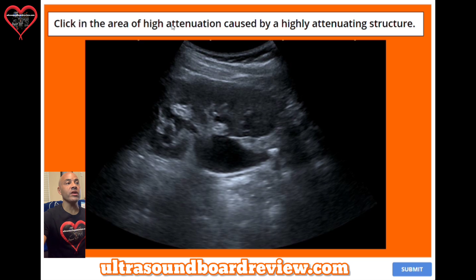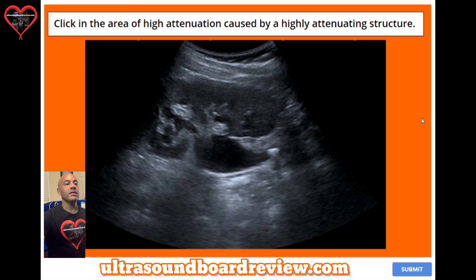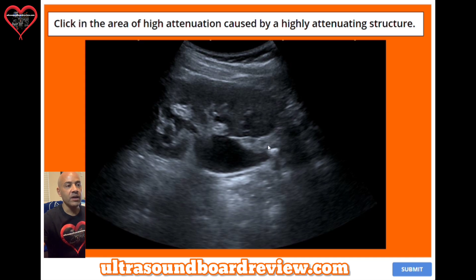Question 50. Click in the area of high attenuation caused by a highly attenuating structure. The answer is right here — if you look closely, there's a little stone right here causing a shadow posterior to that area, so you'd click right there.